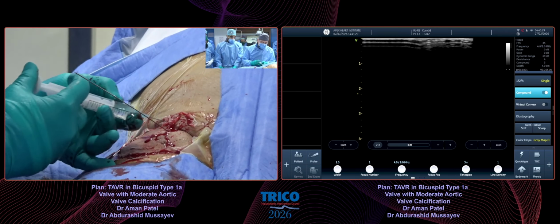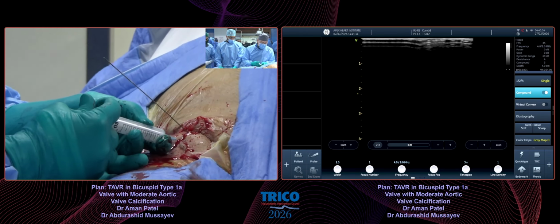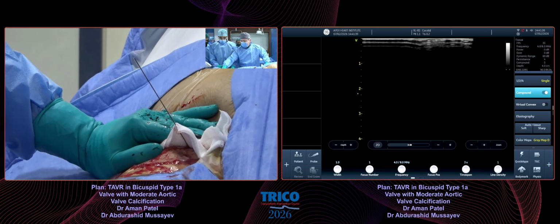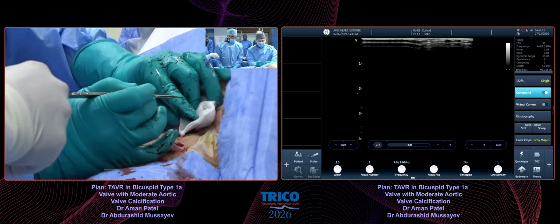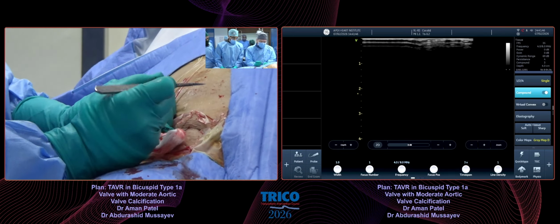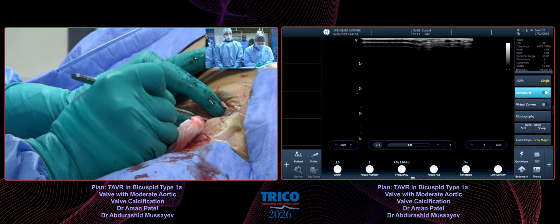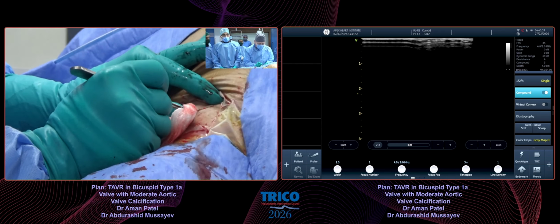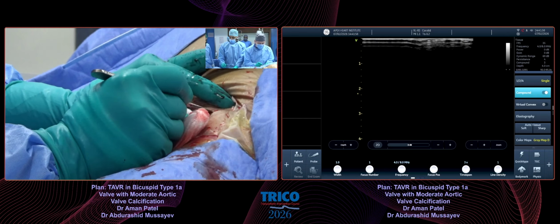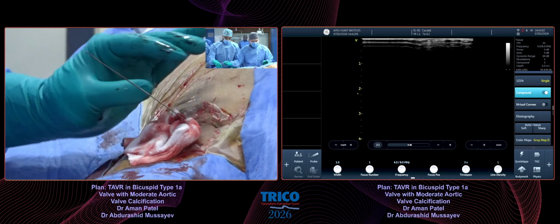We also do micropuncture every time, but I think with a micropuncture, you have to do fluoroscopy, because that micropuncture wire, 1 in 10 times will find the inferior epigastric artery, the deep circumflex iliac, and if you go and put a sheath in, then that's a disaster happening. So for us, every case, we do about 600 TAVRs a year. Every case starts with a CT, then palpation, then fluoroscopy, then ultrasound, then micropuncture, then fluoroscopy. We have to do all of those 6 things for each. But we're always learning and seeing how other people do it in their own efficient way.